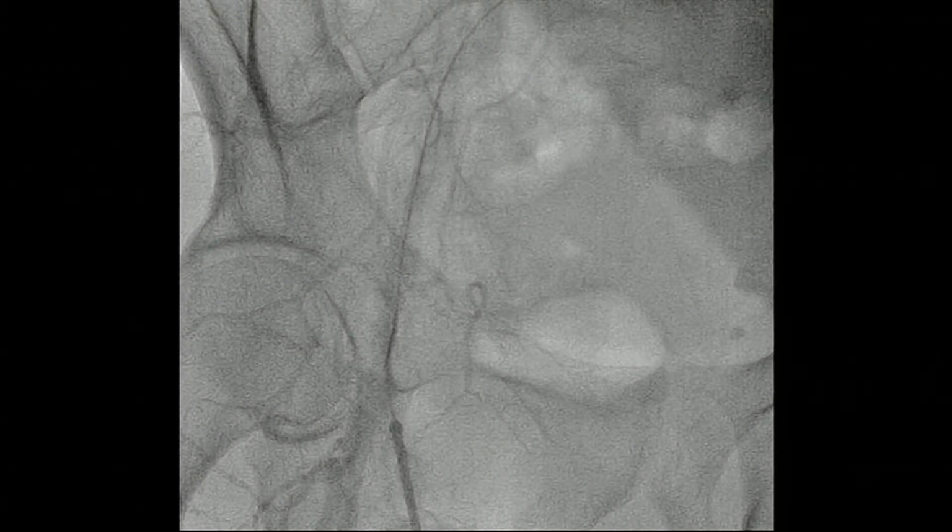Sure. So the way I do it is I insert a 6 French radial sheath, as you usually would in a radial. Following that, you can either use the sheathless catheters that we have, but I prefer the regular catheters because the curve is not the same and the support is not the same. So you take a 5 French pigtail, because it's 110 centimeters, and your guide is shorter, so you have about 10 centimeters sticking out. You just make sure your skin is well open, and then you need to really stick the 2 catheters together at the end so they don't dislodge, and then you insert it over an exchange wire preferably.